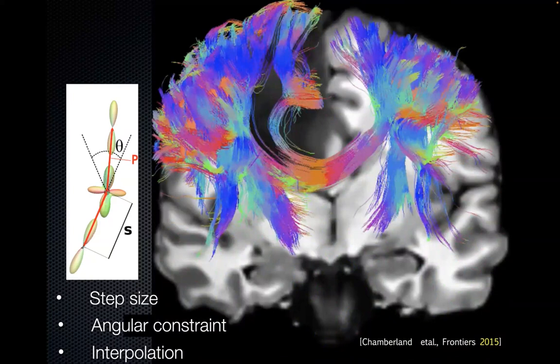More or less. But inside the algorithm, and this is why it's important, especially if you go to microscopy or macaque or mouse, suddenly these notions of step are smaller because the pixels are smaller, and you need to adjust the parameters. Because remember that all our parameters are fixed for typical 1 by 1 by 1 millimeter MRI data. But all of these are options. How do you step in white matter? Luckily, we've been doing this for almost 15 years now, so we have good priors on what's a good step size, what's a good theta, based on the data you're providing.